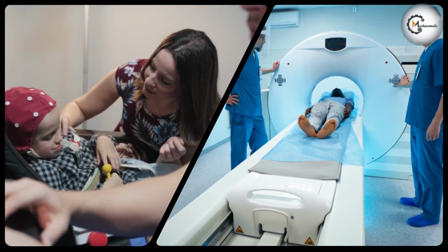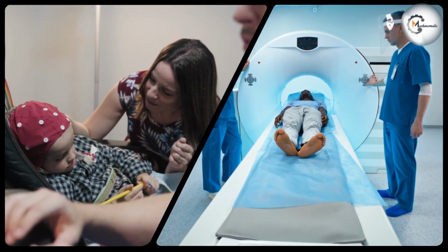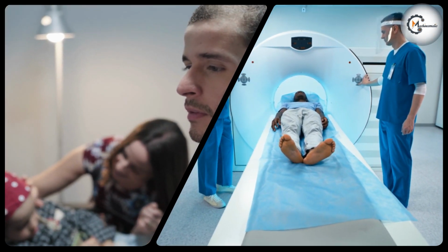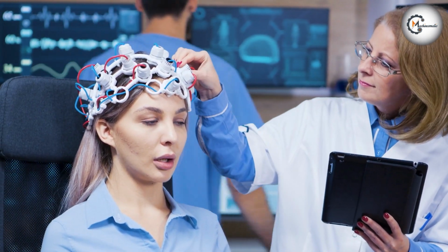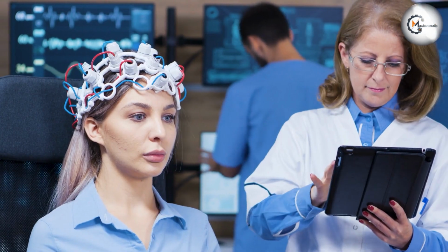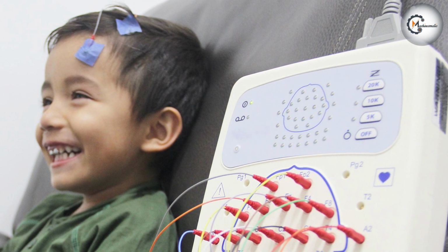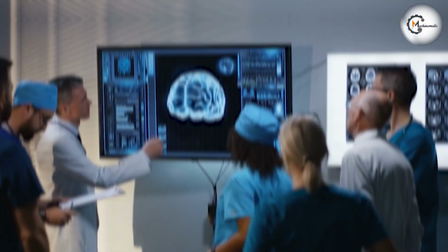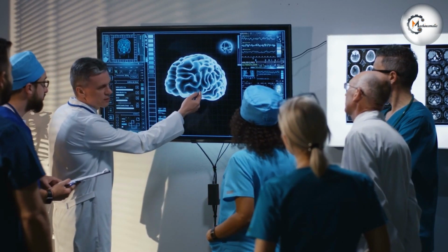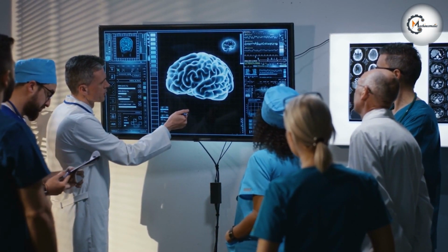EEG and MRI machines are two popular diagnostic tools used in the medical field to detect neurological abnormalities in patients. Both techniques are used to diagnose autism in children, but they differ in their approach and the information they provide. Electroencephalography, EEG, measures the electrical activity of the brain, while magnetic resonance imaging, MRI, provides a detailed image of the brain structure. Let's take a closer look at these two methods and compare them in detail.